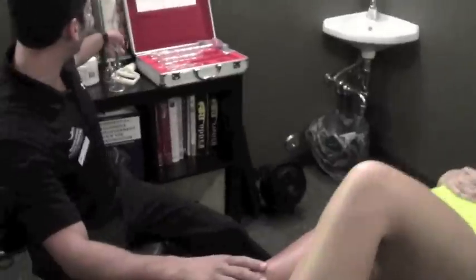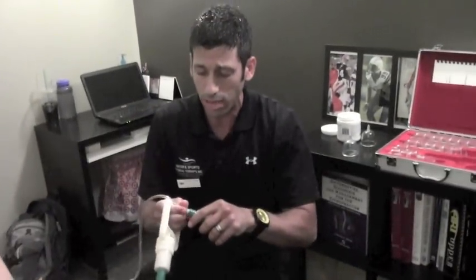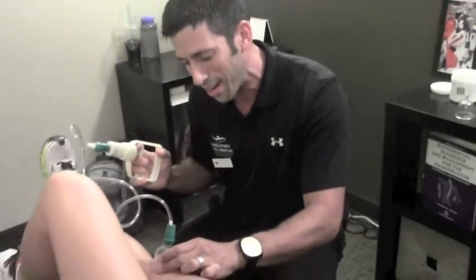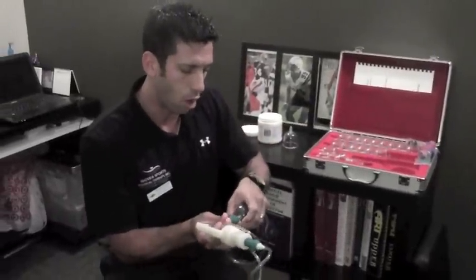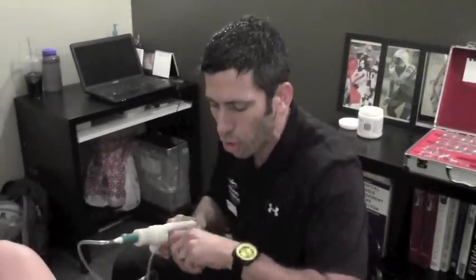We're going to talk about myofascial decompression — that is cupping — and we use a pneumatic device. Most physical therapy clinics and practitioners do not do this, and if they do, they usually don't apply it the way we do. It looks sort of gross, so don't let it scare you. What happens is we actually use negative pressure to pull the tissue up into the cup, and we can do this in multiple areas along the length of the IT band. What we try to do is get the tissue between the IT band and the quads to pull and release that connective scarring.